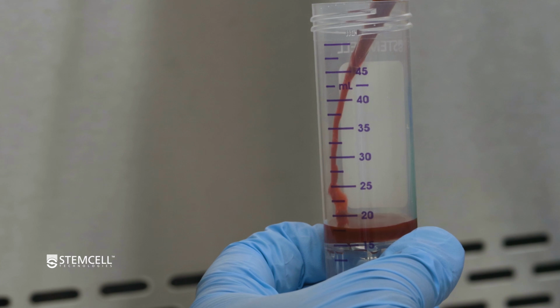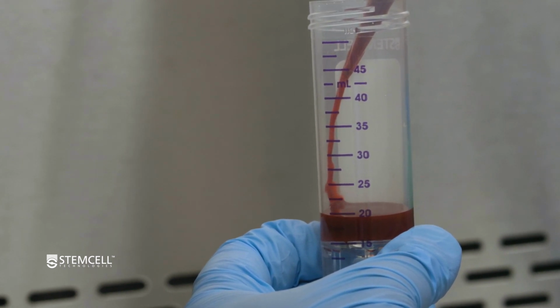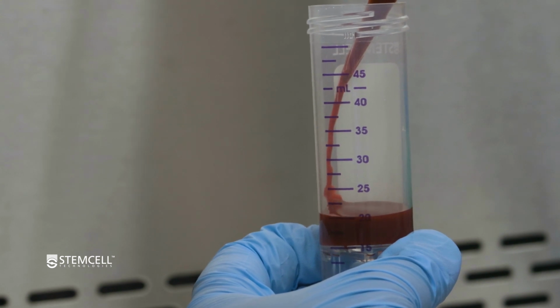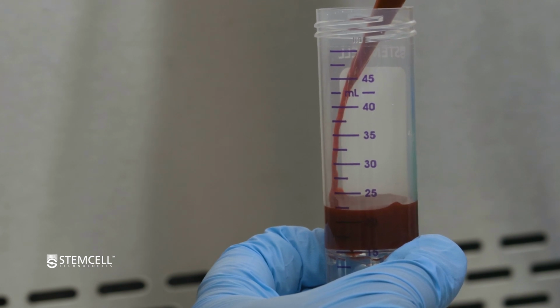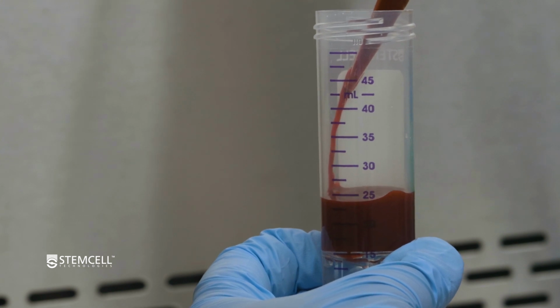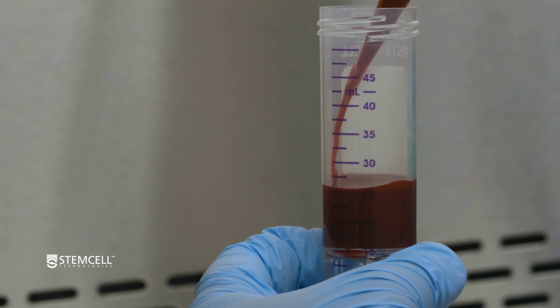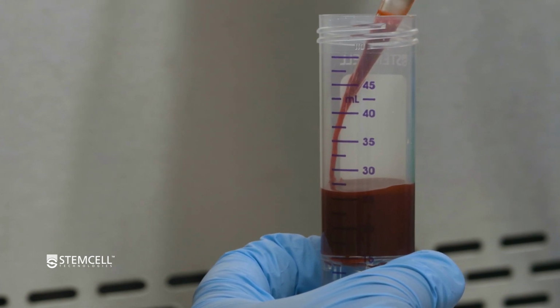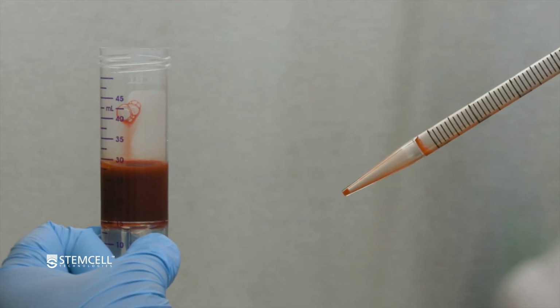You'll also notice that there will be a little bit of mixing between the dispensed diluted blood and the Lymphoprep. That's perfectly okay. As well, you might get a little bit of the whole blood going underneath the insert, and that also is okay. A good tip to give you is that when you're dispensing, you should keep the tube vertical. This will help minimize how much of the blood can mix in with the actual density underneath. Now be aware that you are going to get a little bit of the whole blood going just slightly underneath the insert, but this is perfectly normal.